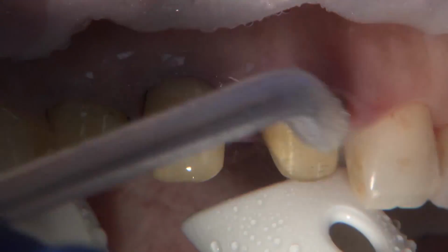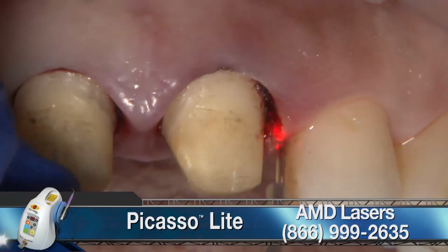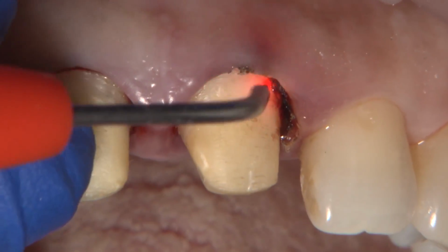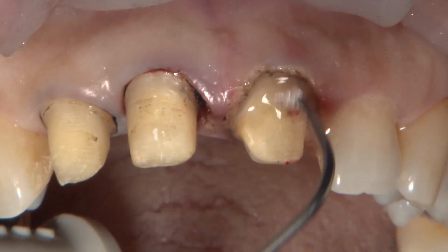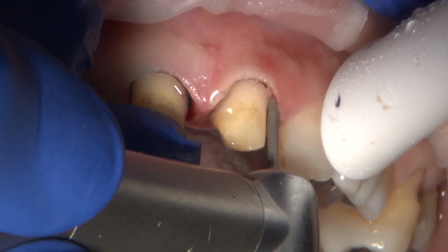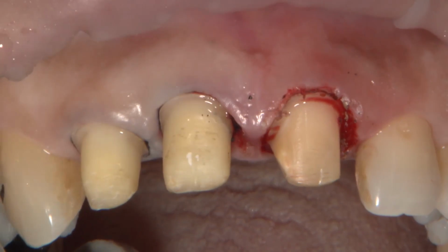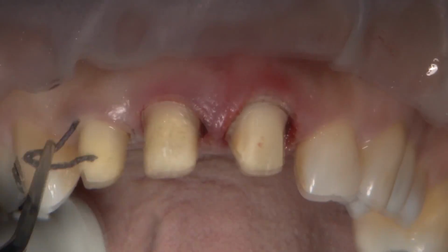Because there was a lot of bleeding, I am using here the Picasso laser to do a sulcular debridement and remove the inflamed tissue on number 9. I had the laser set on basic at 0.8, continuous wave for 20 seconds, making sure I am short of the pocket depth. I use a diamond burr from Axis Dental to smooth the margin. Then I use the laser to bevel the gingiva. Note how the nicked tissue went away.